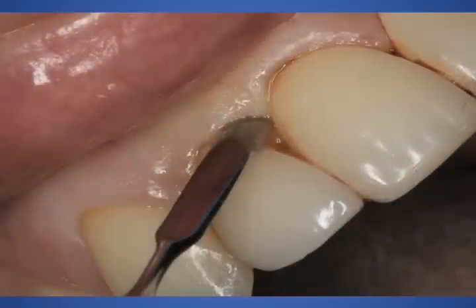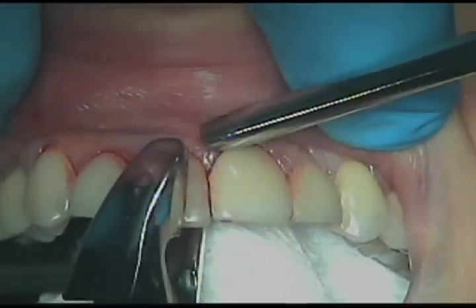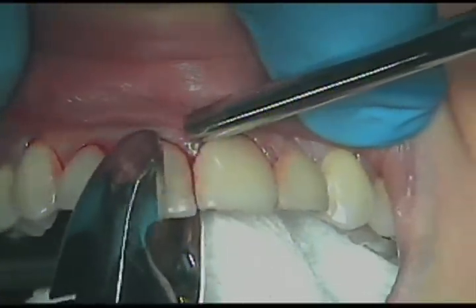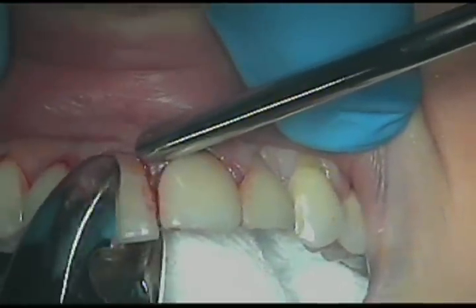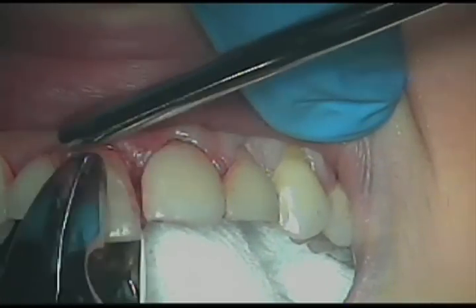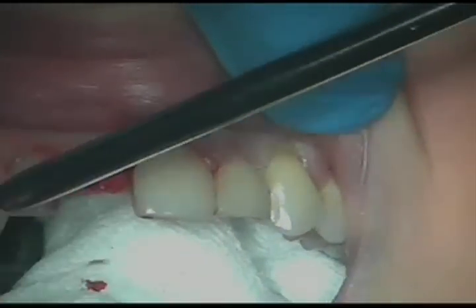Here we're using a periotome to simply break the periodontal ligaments around the teeth that we are going to extract. And let's run a little video here. On the extraction, we want very careful extraction. We take a lot of time in removing of the teeth so as not to disturb the buccal plate at all.